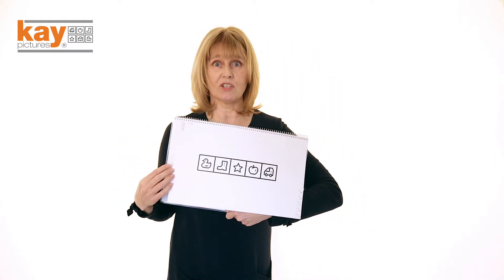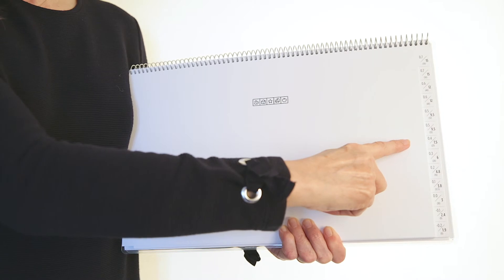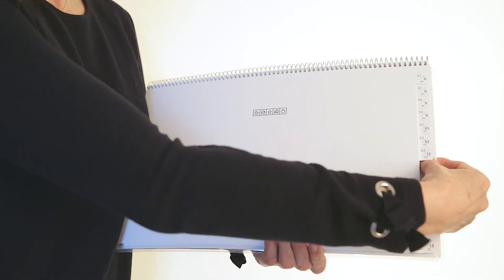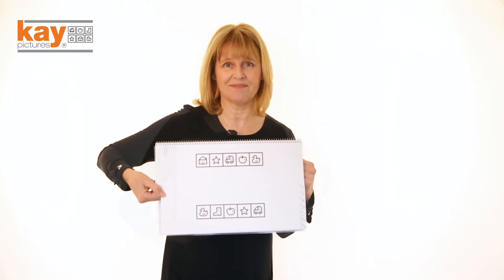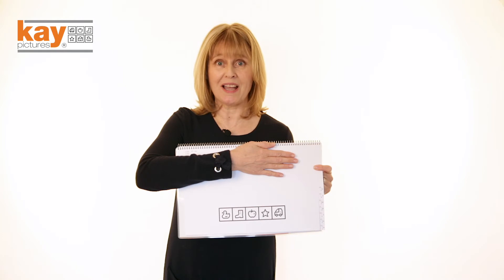Then choose a smaller size again with your thumb, flip that page over and show it to the child, always ignoring the pictures facing you. You do have detailed information in the top left-hand corner for the size and information of the picture facing the child. You'll notice that some of the sizes have two tabs, because every size has two different arrangements of the pictures, and the smaller sizes have two arrangements on the same page. Where there are two rows of pictures, you can cover up the one you're not using so the child knows where to look.